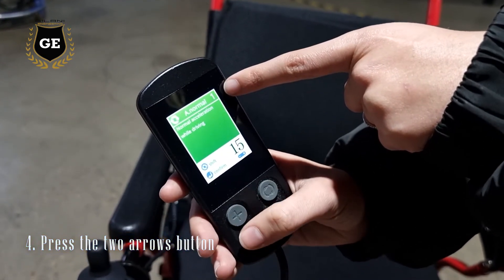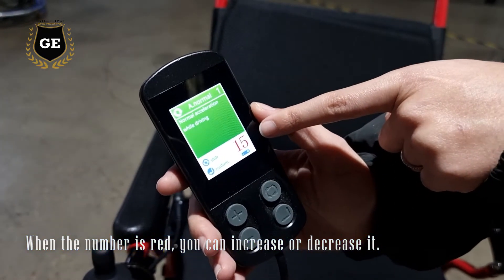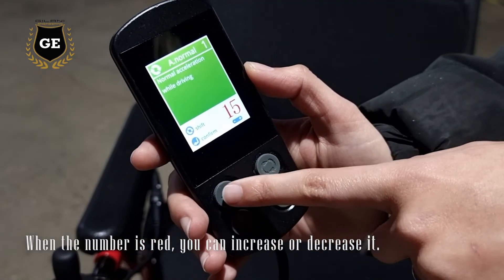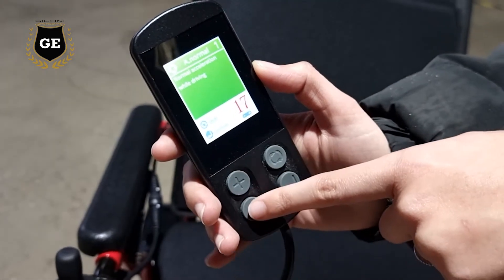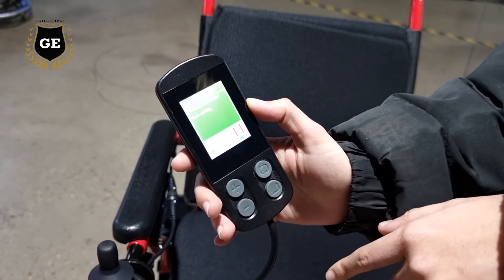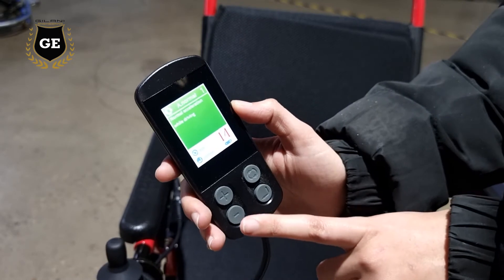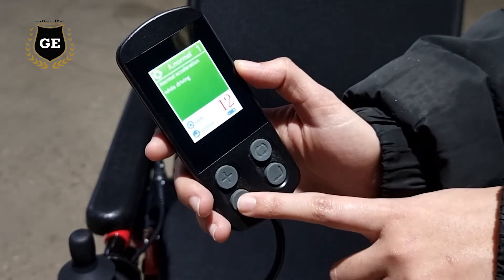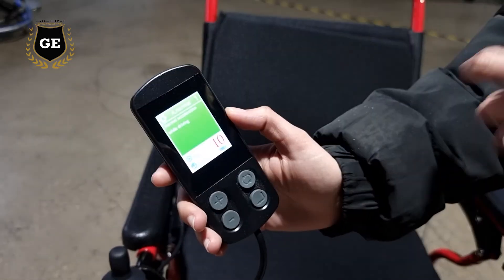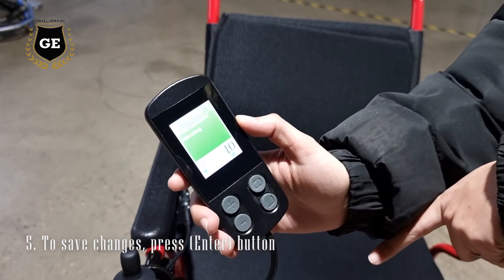To increase acceleration, just press this button and you will notice the number go red — that means you can change it now. To increase that number, press the plus button, and to decrease the number, press the minus button. If I want to reduce the acceleration of this wheelchair, I'll keep pressing the minus button until I have the desired number — I want to change it to 10. Now I'm going to press the enter button to confirm that change.